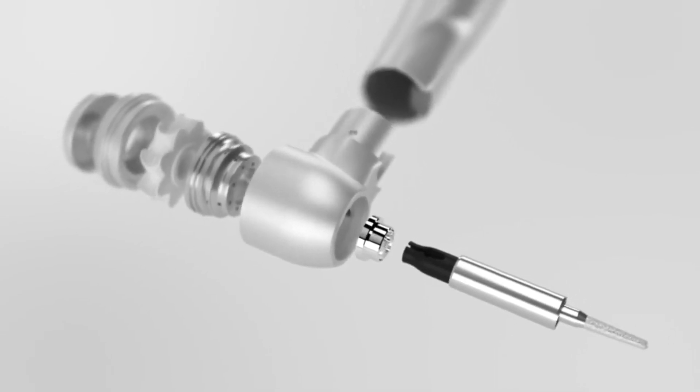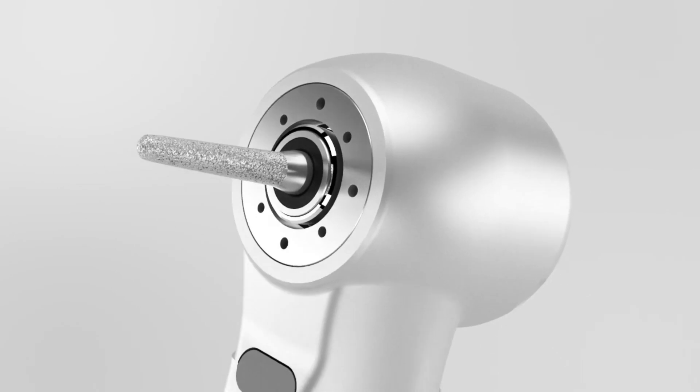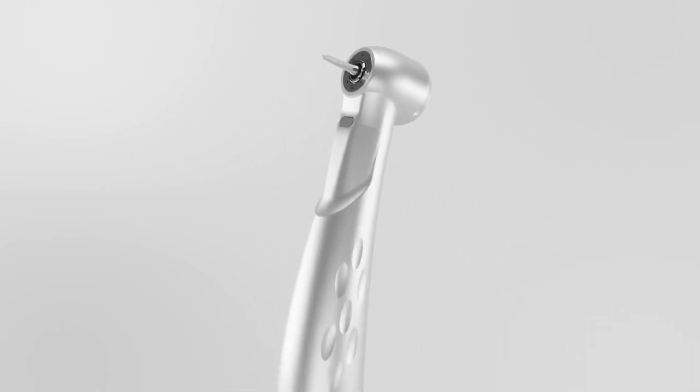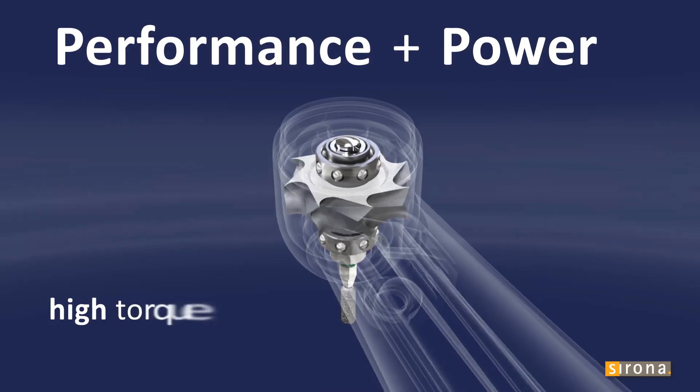High-speed attachments have a chuck gear five times smaller than the drive gear. Slow-speed handpieces have chuck gears that are larger than the drive gear, which decreases the speed of the burr.